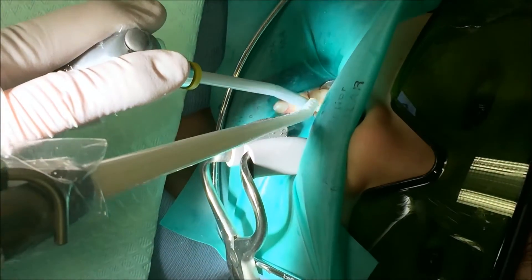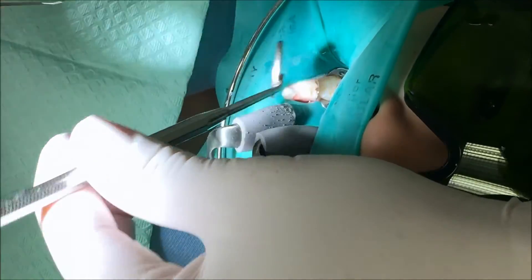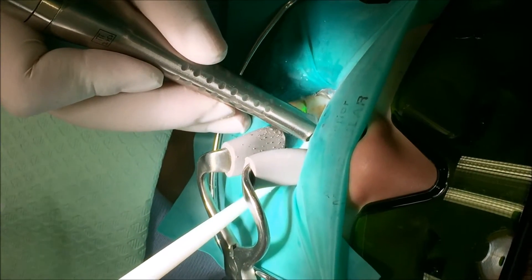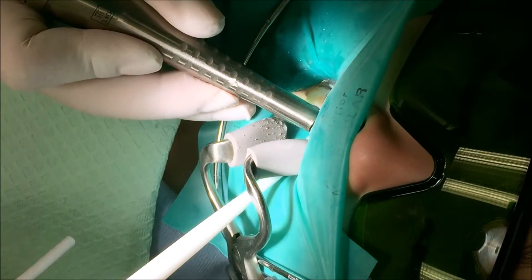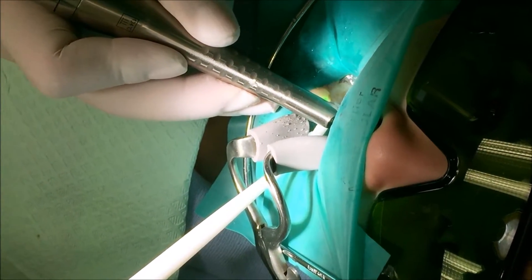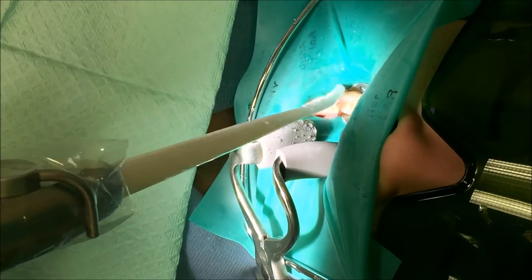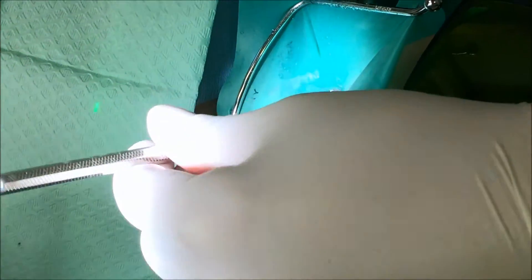Take a look. Can I have a tooth toucher, please? Oh, we are almost there. Just a little bit more on the cheek side here. Let's put it down, let's put it inside, let's pour it down. A little bit more on the chewing surface and we're done.